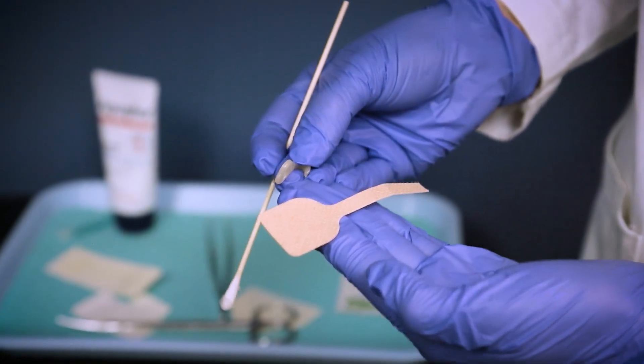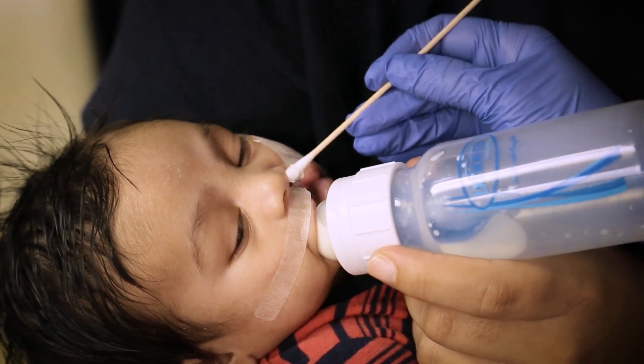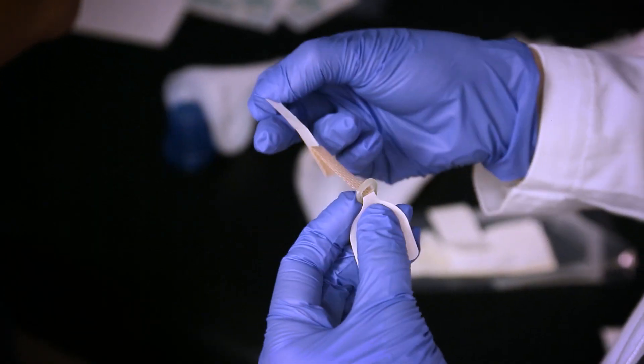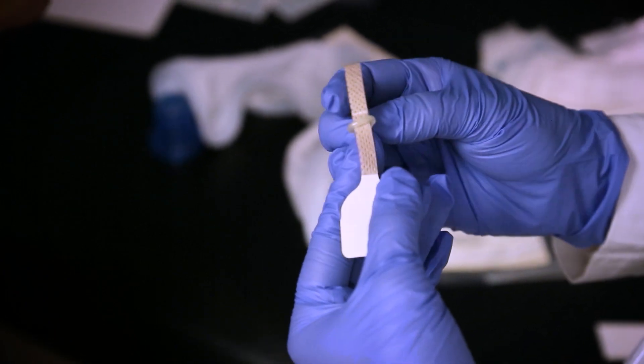Next, let's look at the nasal former. To use this successfully, you should gently Vaseline the nose first. Place the tape through the plastic nasal stent — you can cut and adapt the tapes based on the size of your baby's face.